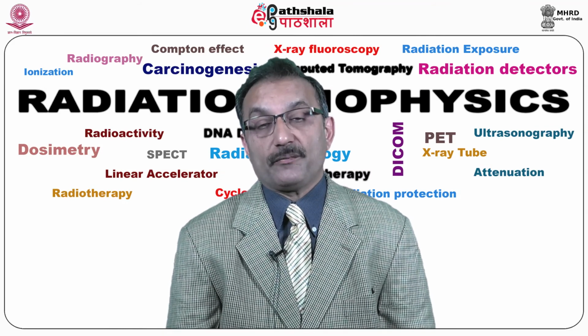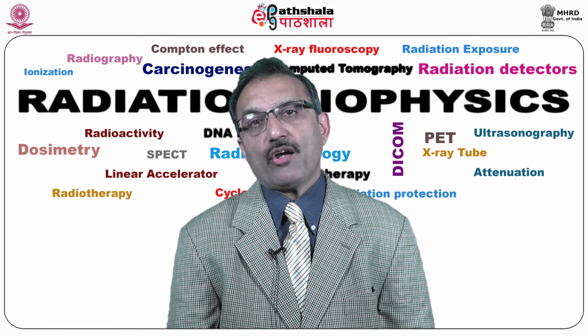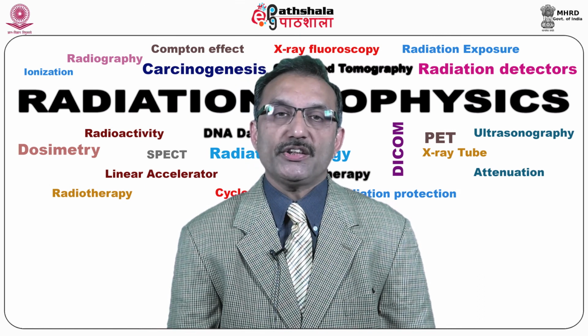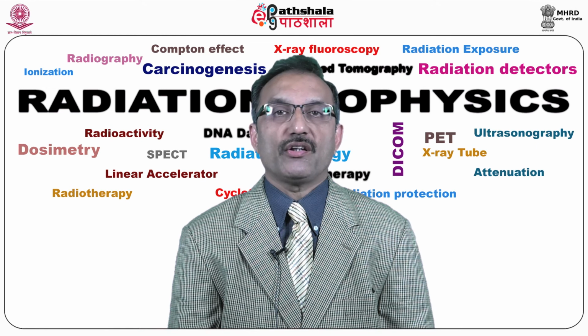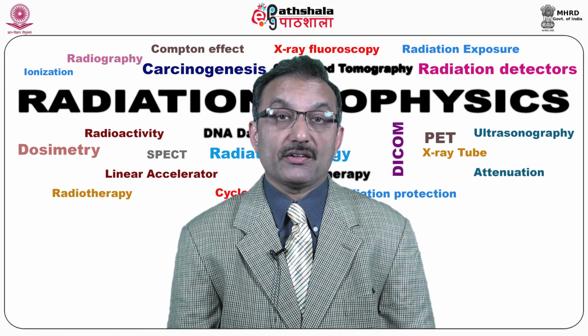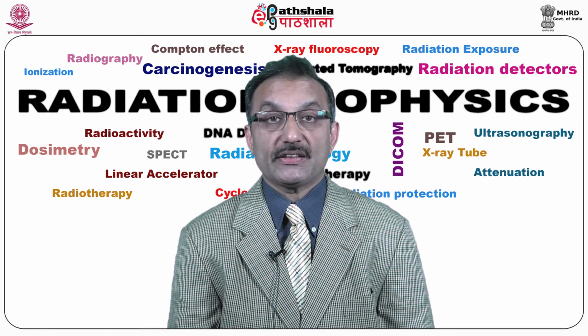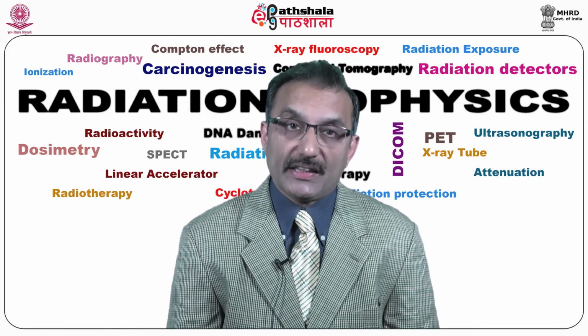But it does not mean that you give less activity and keep on acquiring until the patient moves, because the patient is not comfortable on the couch for a longer time. And it is also not advisable that, because the patient is not comfortable and you want to finish the scan in less time, you give a larger activity.